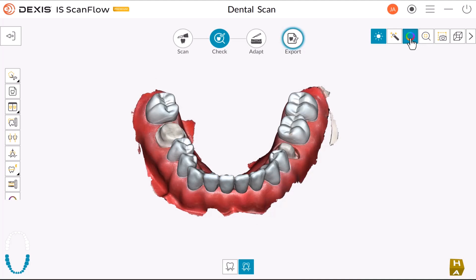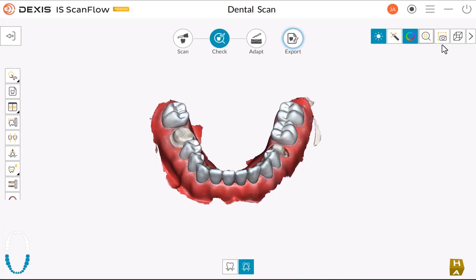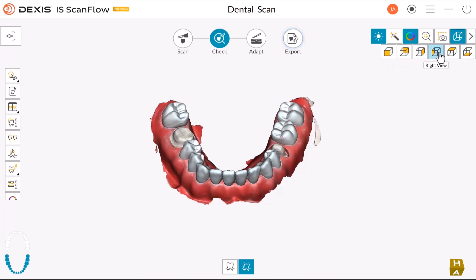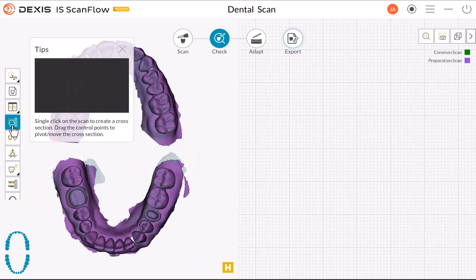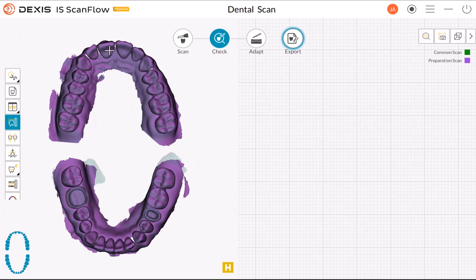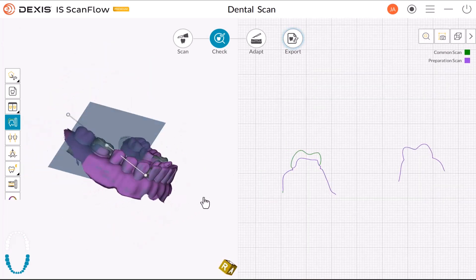Click here to turn on the environment light. Click here to turn on color. Click here to scale the model to its best view. Click here to view 6 different views: front, back, left, right, top and bottom of the model. Click here to take a snapshot of the image. Click here to display the preparation check window, where you can superimpose the common view and the preparation view to take a distance measurement.